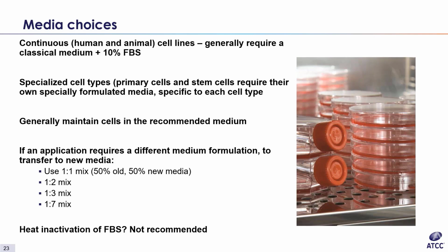ATCC does not recommend using heat-inactivated FBS under normal circumstances because it can denature growth factors necessary for the health of the cell.